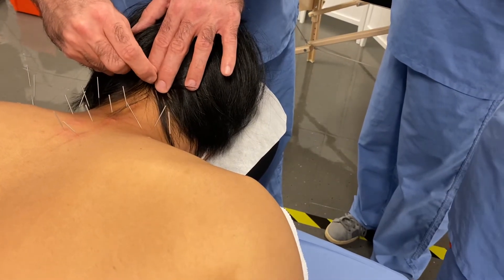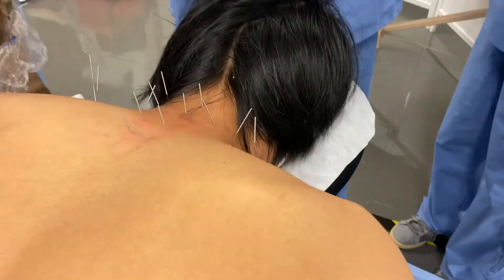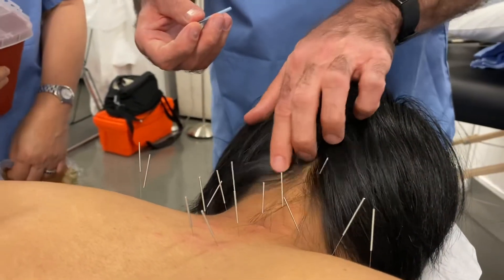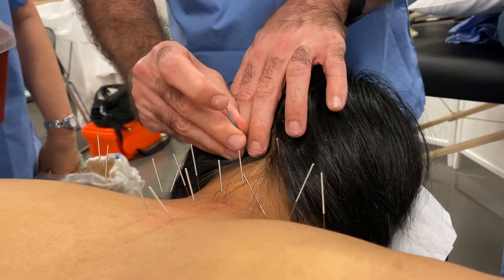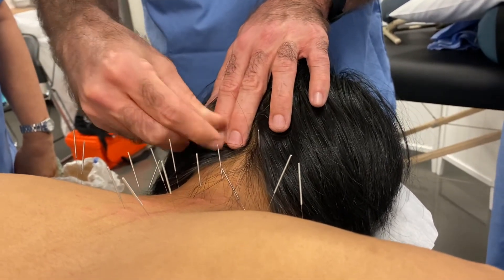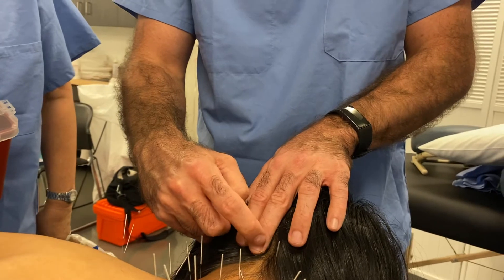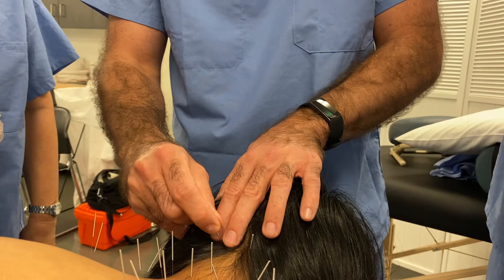Any achy there, Michael? — A little bit. Let's do the same thing on this side. You'll find a tight band, so you get the band between your fingers — holding it in place to needle it. Got one on one side with this finger and one side with this finger. And a little in-and-out technique.